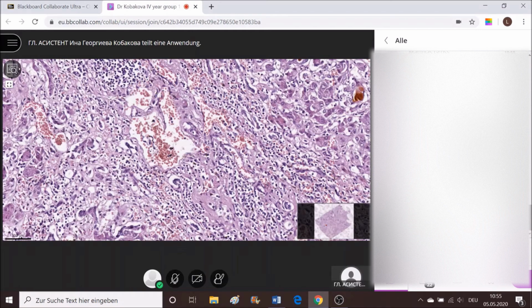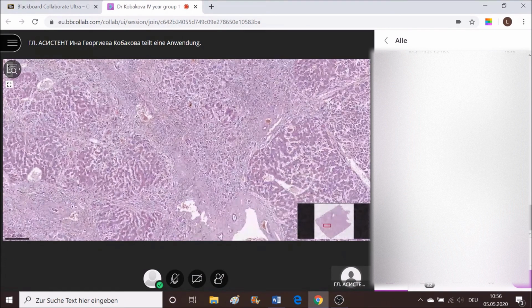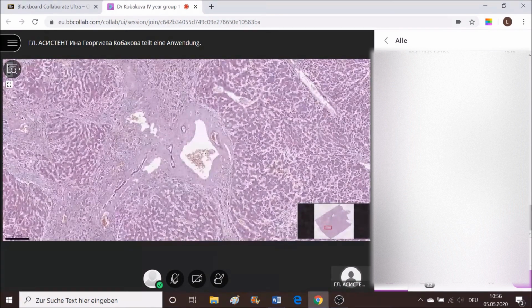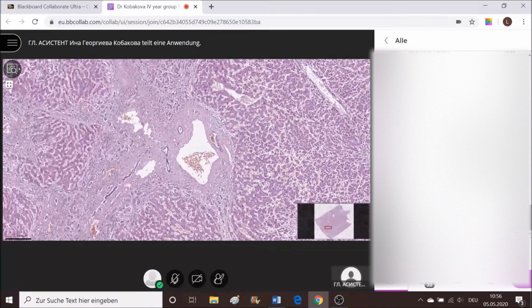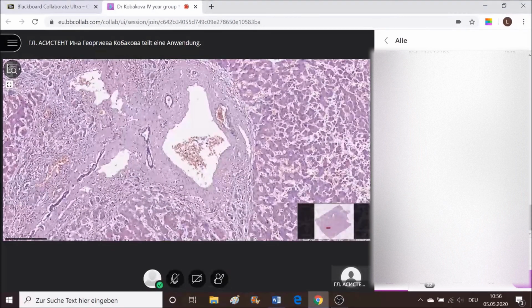Remnant one here. It's a little smashed, not quite informative. Let's take a look at others. Now this one is very well distinguishable, but it's not properly connected morphologically to the surrounding structures of the regenerative nodules, and that is why it's not functioning well. We can see proliferation of bile ducts here. And here one more.